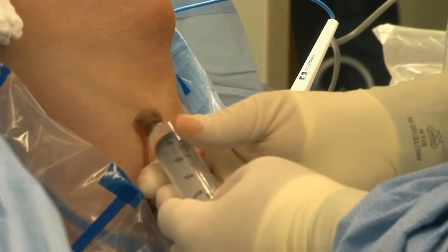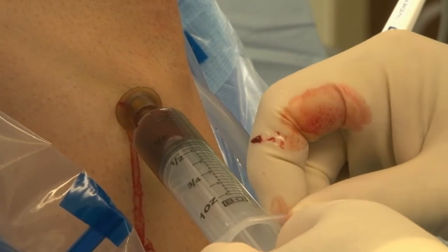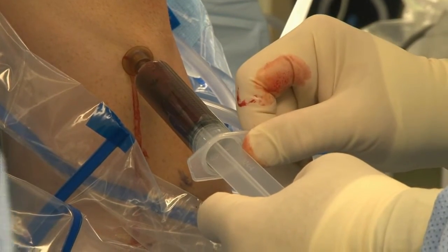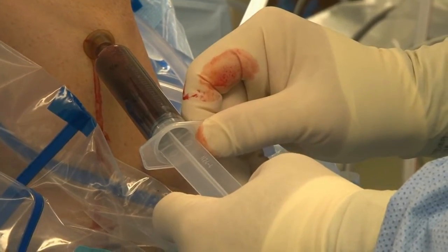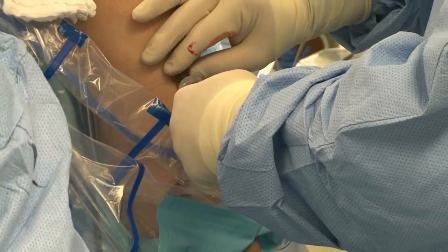Step 9. Attach a syringe to the luer lock threads on the catheter hub and begin marrow aspiration by gently pulling back on syringe plunger. Slight downward pressure on the catheter will assure its stability. Repeat this step as many times as needed to collect the desired amount of marrow. Hand each marrow-filled syringe to the centrifuge processing technician.